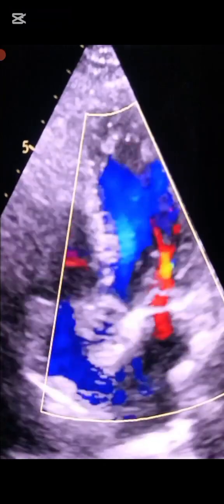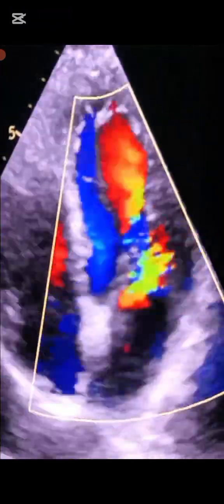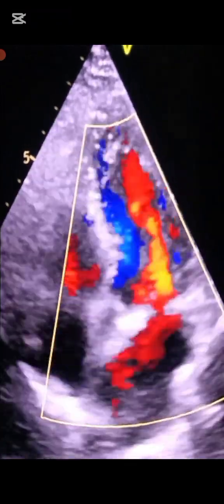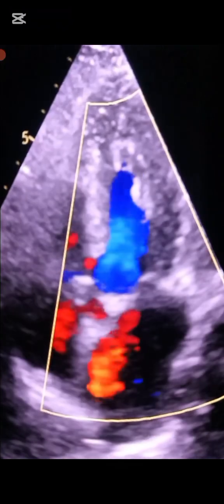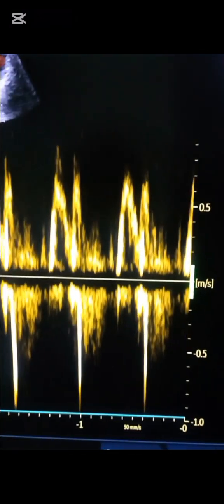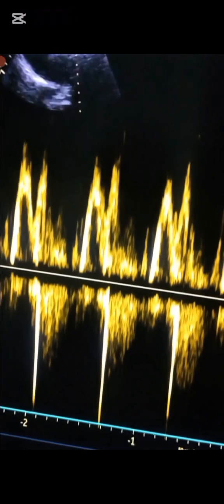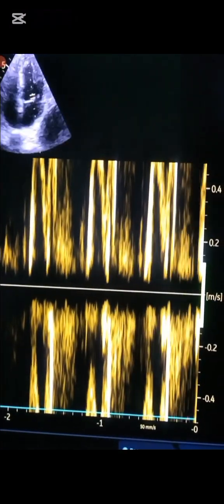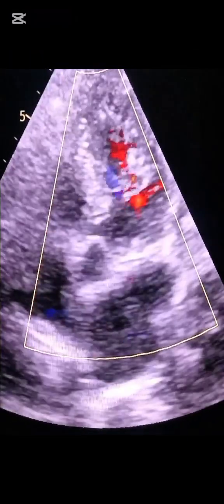The disadvantage of pulse Doppler is that it only records low velocity flow, limited by the Nyquist limit — the maximum measurable flow detectable by pulse Doppler. Beyond that, there is aliasing, which means the signal appears both above and below the baseline. Aliasing is a feature only of pulse Doppler and can be removed by increasing the velocity scale.